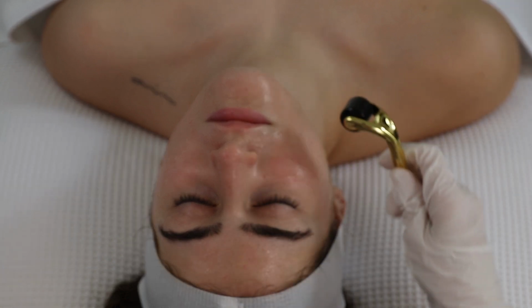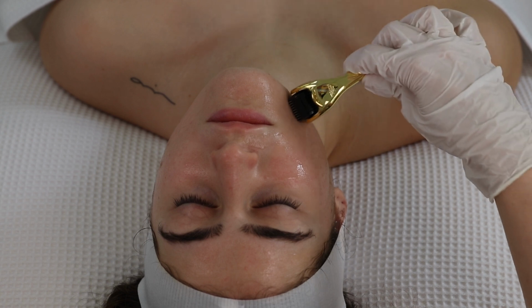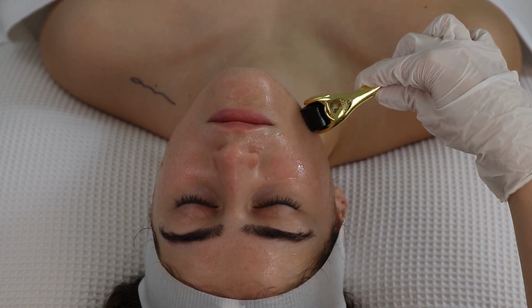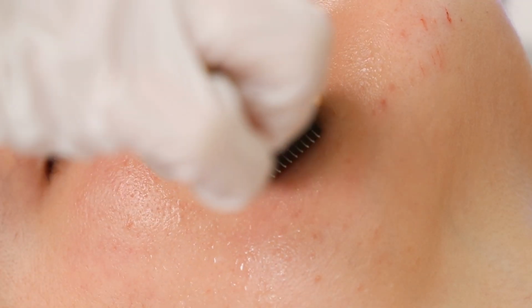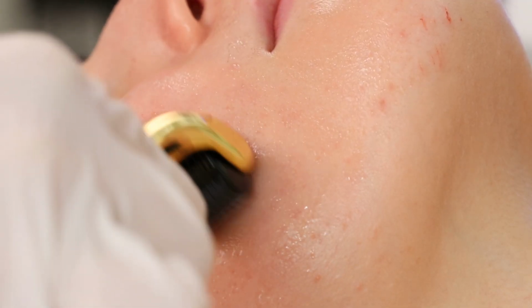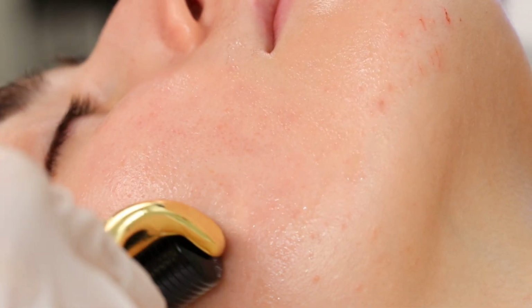from the right side of the face near the chin area, and you're going to move upwards towards the jawline and the cheek. We're using quick, small strokes, and we're also applying very little pressure and consistently changing the direction as to where using the dermal roller from horizontal to vertical.